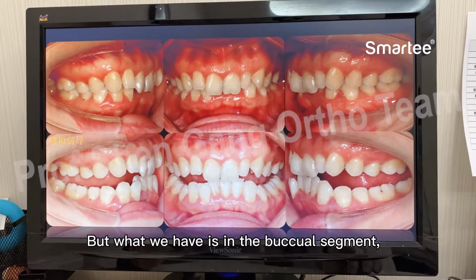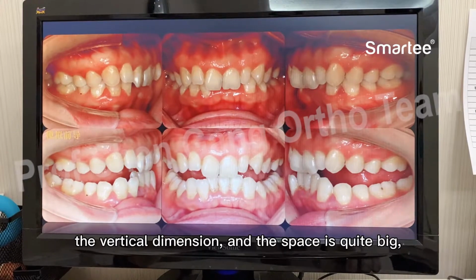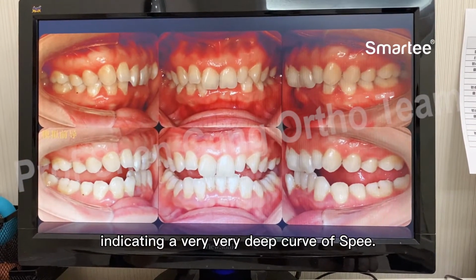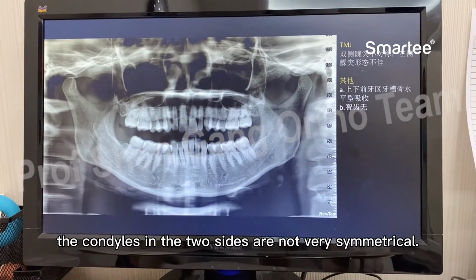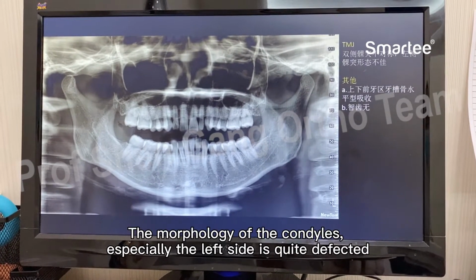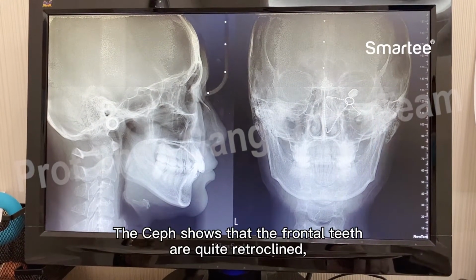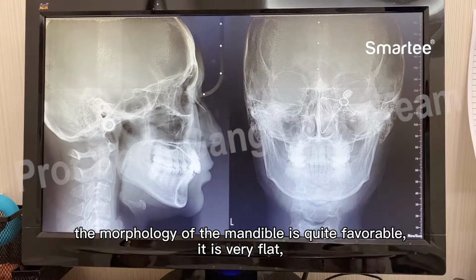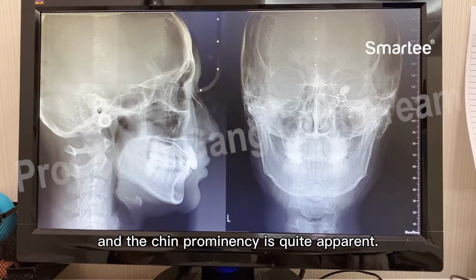But in the buccal segment, the vertical space is quite big, indicating a very deep curve of Spee. And the OPG shows that the condyles on the two sides are not very symmetrical. The morphology of the condyles, especially on the left side, is quite defective. The lateral cephalogram shows that the frontal teeth are quite retroclined, and the morphology of the mandible is quite favorable. It's very flat, and the chin prominence is quite apparent.